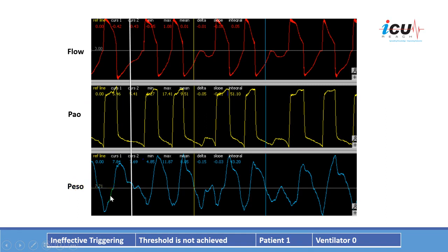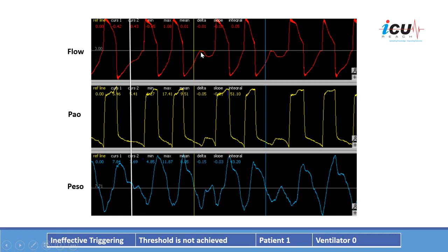You can see that every drop in esophageal pressure results in a ventilator breath — there is a drop here, and a ventilator breath here, and similarly in this one. However, in this case, there is a drop in esophageal pressure indicating that the patient has effort, but this effort was not effective in triggering the ventilator breath. You can see the drop in pressure and the rise in flow, but it did not trigger a ventilator breath.